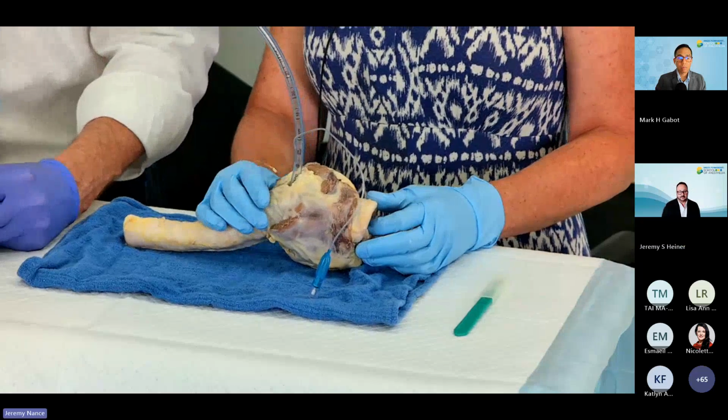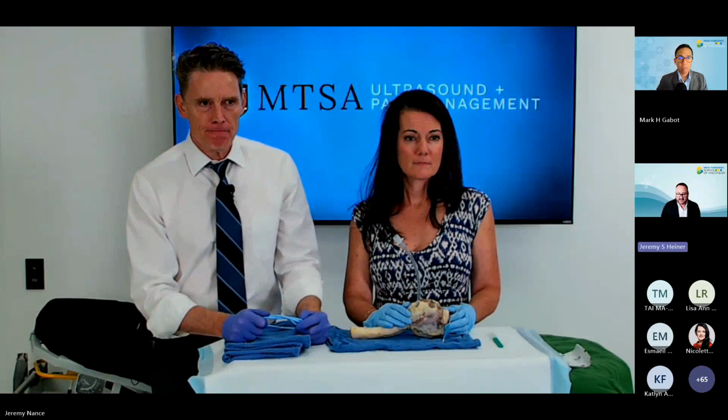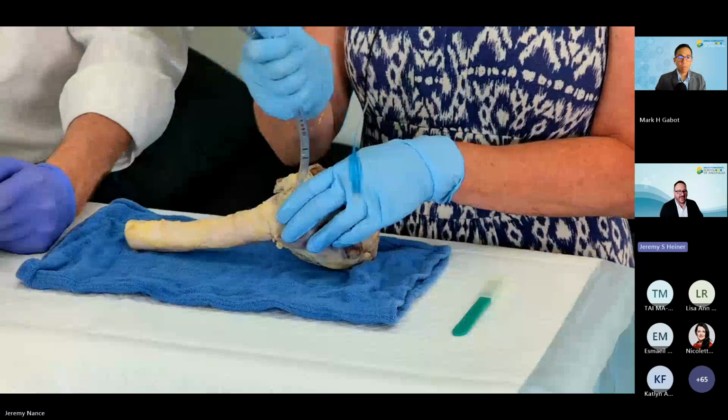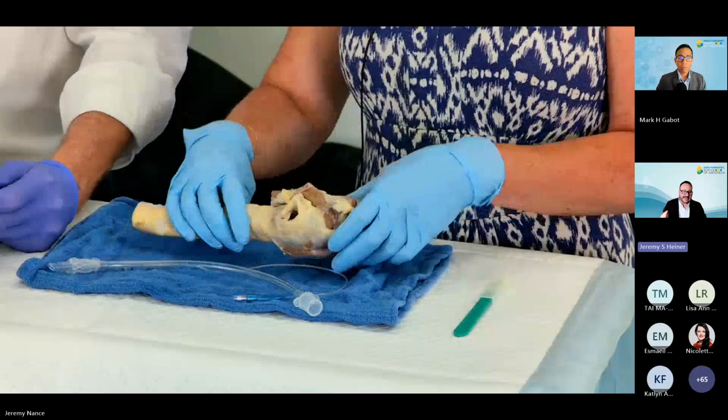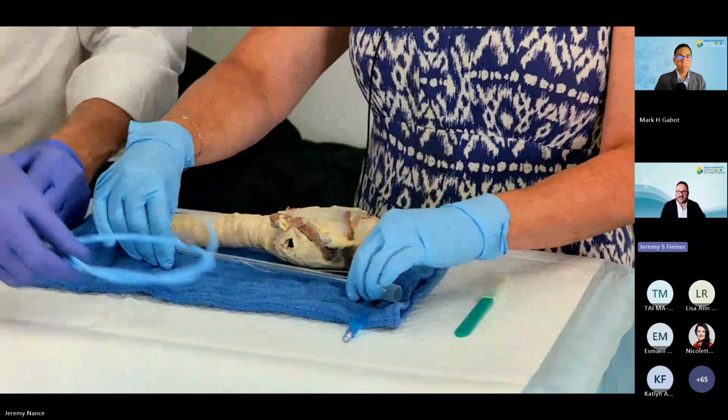Okay, but for the actual puncture of the cricothyroid membrane itself, it's a transverse incision, correct? Yes, perfect. Once you know where that membrane is located, it is now a transverse incision. You want an incision big enough that you can get your finger into that incision.